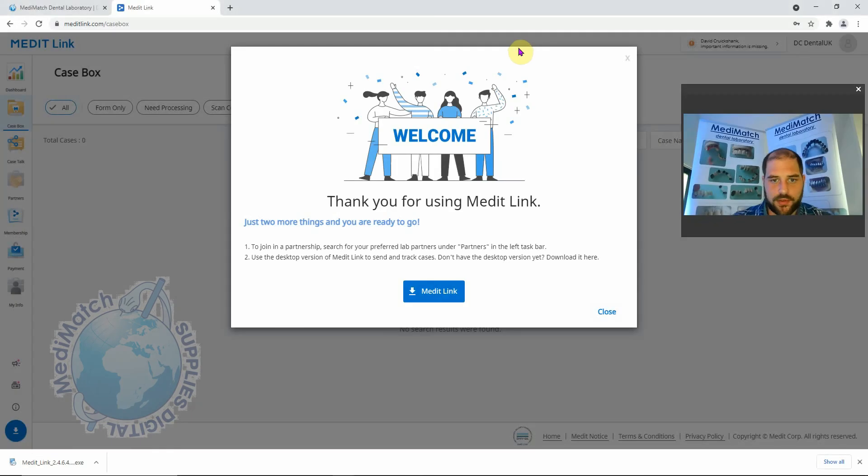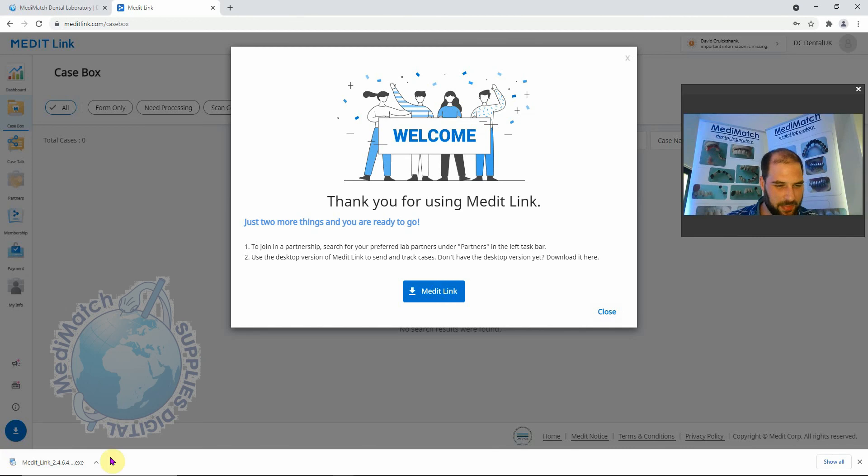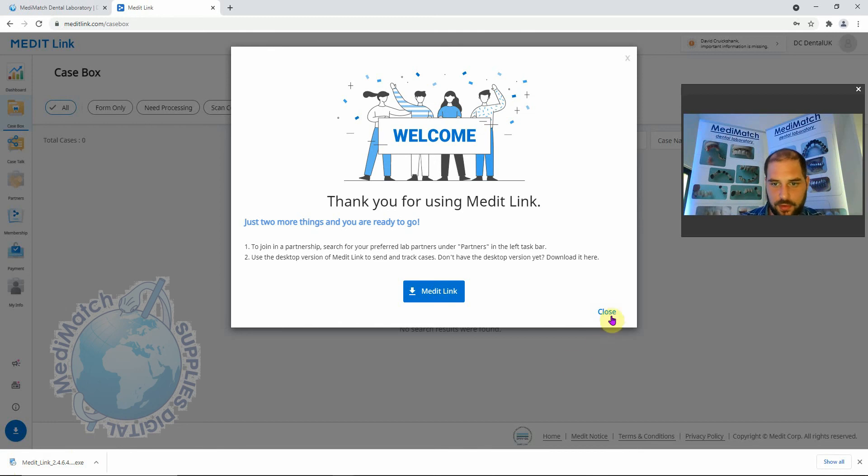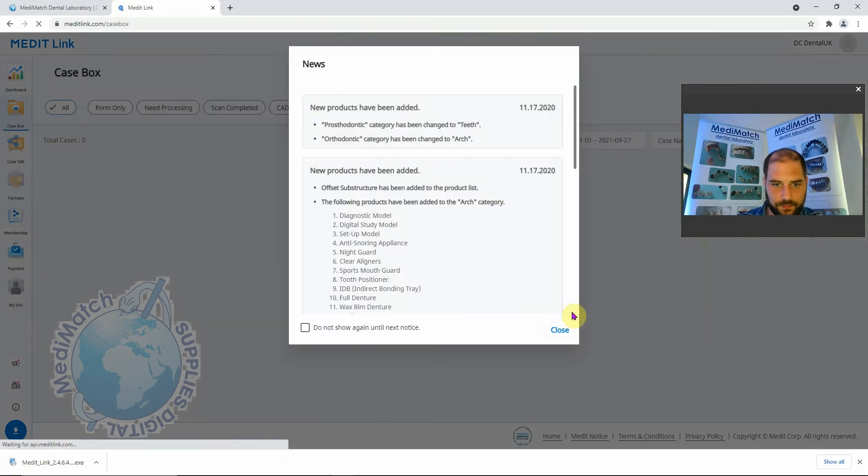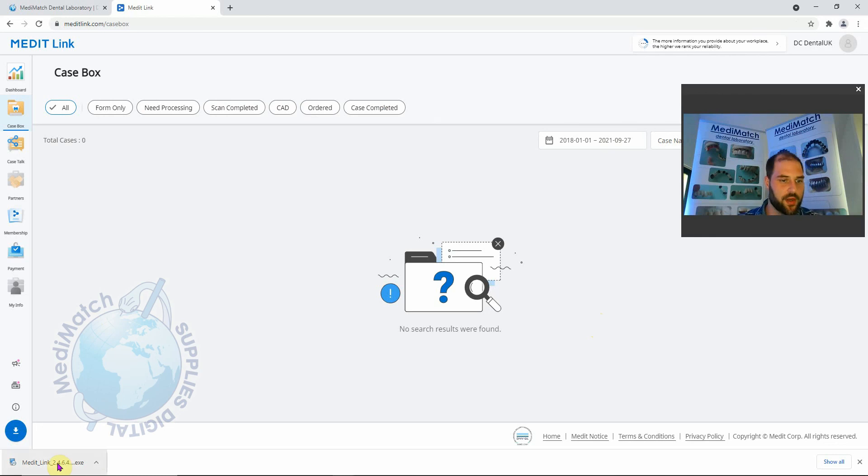We're back and the software, the installation files are downloaded. I should have said before that this takes about 1.2 gigs, so just bear that in mind when you're thinking about space on your system. Let's get rid of this, close these again, and we're going to click on the download.